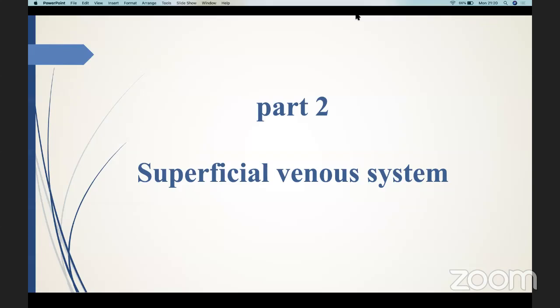When you scan your patient with suspicion of May-Thurner syndrome using MRI, it would clearly show that the compression is there. So venogram and MRI are quite important modalities for scanning patients in certain circumstances and certain conditions.